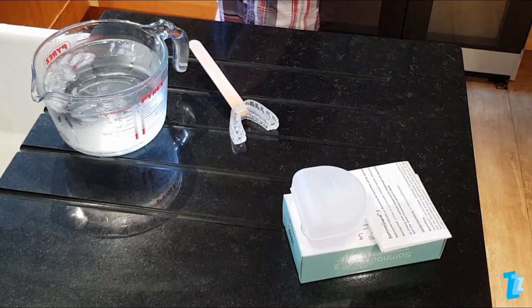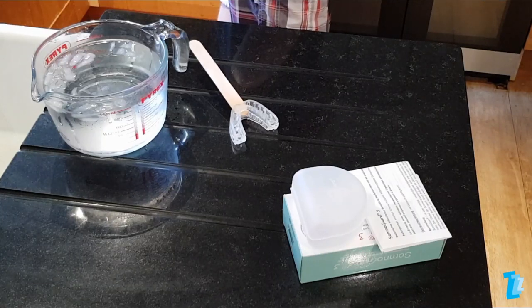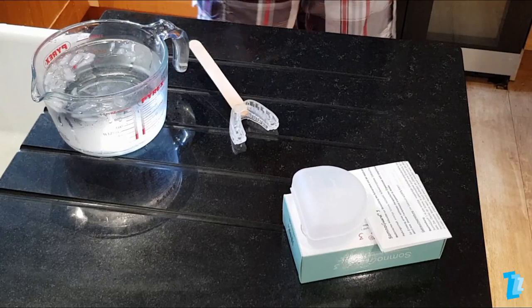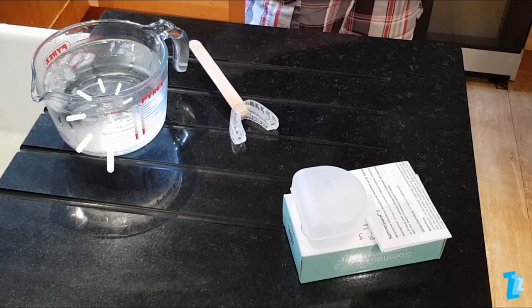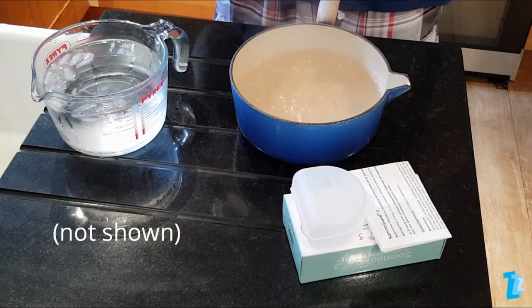Firstly, prepare everything needed to fit this device. The instructions — read them carefully — the device itself, the spatula, a bowl of iced water, a saucepan of boiling water, and a clock that shows seconds.